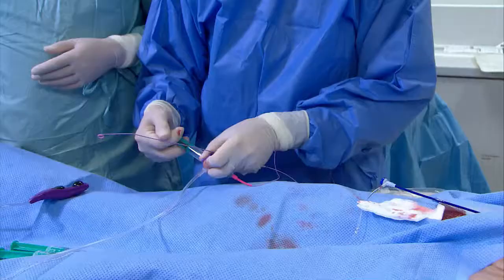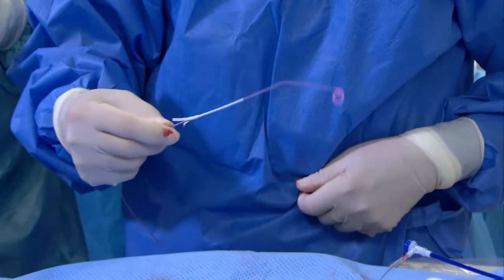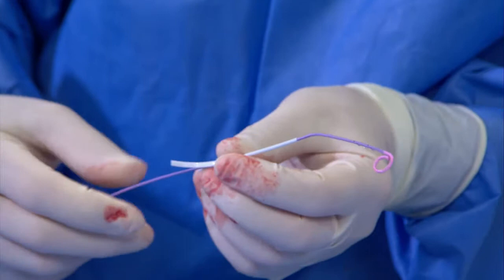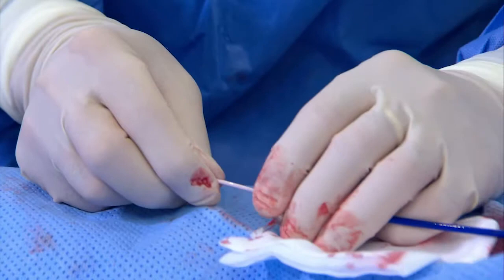The next step is to engage the left atrial appendage. The pigtail 4-French angled-tip catheter is used to engage the appendage — the small distal tail and its angle are both important features to get access. The transeptal puncture set is still inside the left atrium while proceeding with the pigtail to the left atrial appendage.